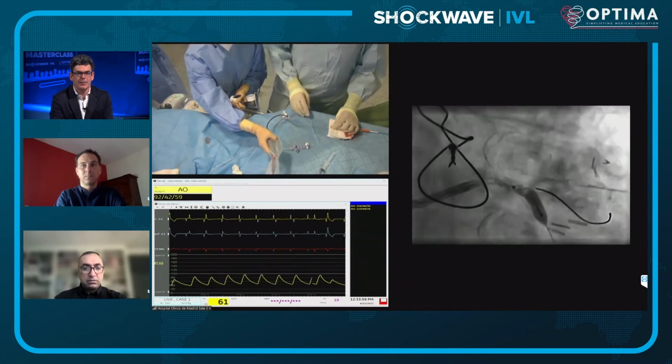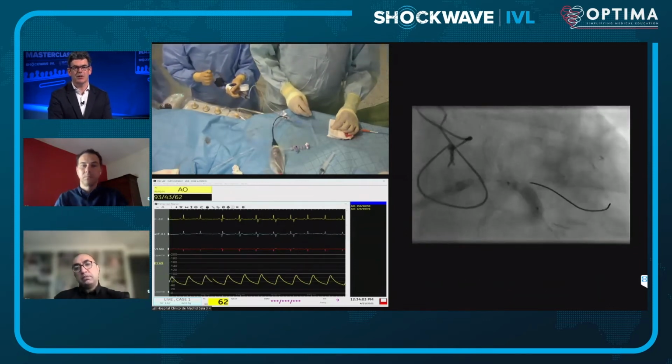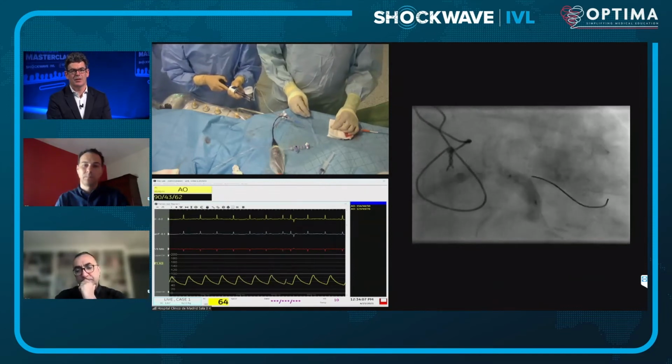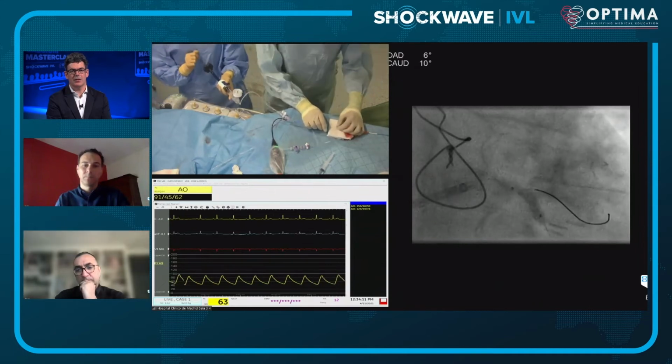There we are. Yeah. And you can see the cavitation bubbles around the emitters in the proximal segment there. Exactly. We can move a bit more proximal now, I think. Yeah, absolutely. So perhaps to completely straddle this, the lesion.